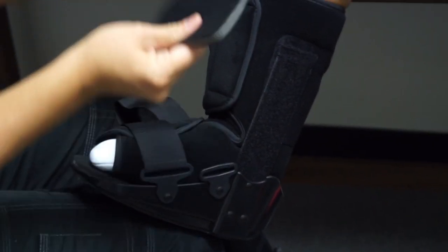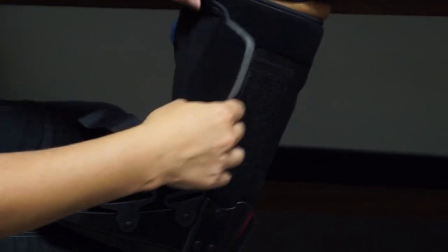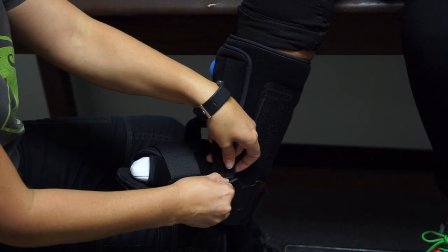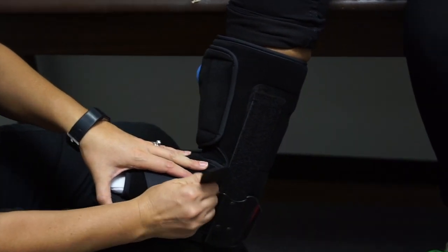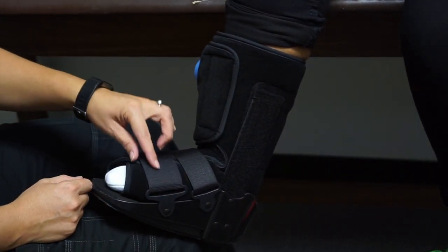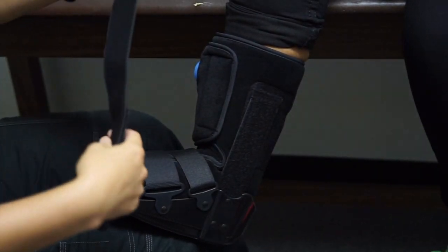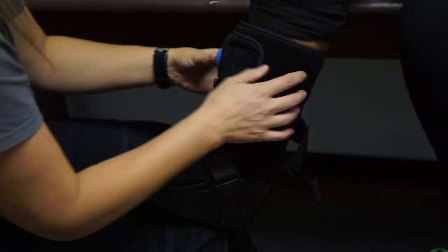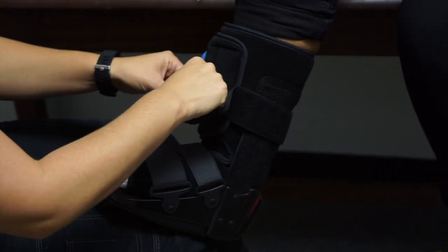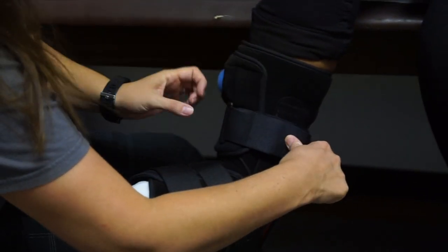A side note: these little pads can be shifted to wherever they're needed if a strap or area is bothering the patient. If they don't need them, that's fine — they have two extra pads. The boot should be nice and snug. Depending on the fracture — for example, a foot fracture — you may want to keep it a little looser on top of the foot. The goal is to keep the whole ankle unit immobilized. The final strap goes right below the pump — nice and snug, not too tight.